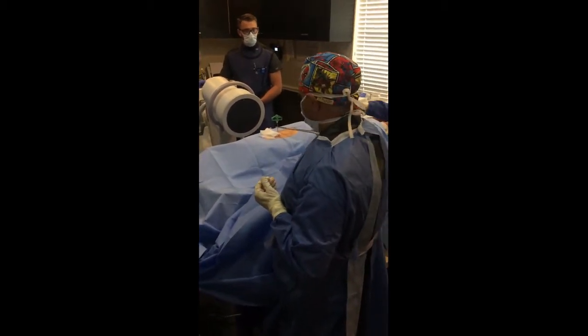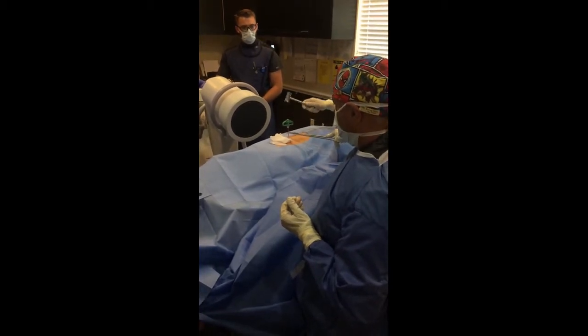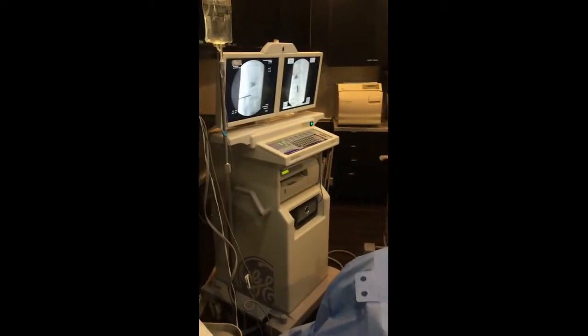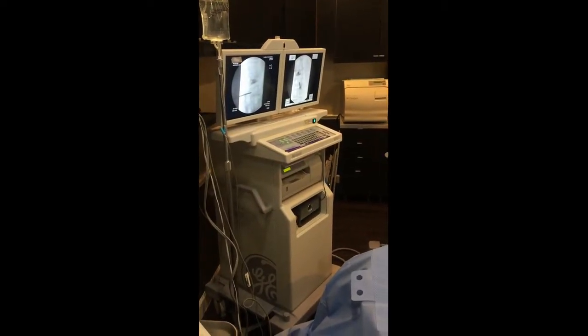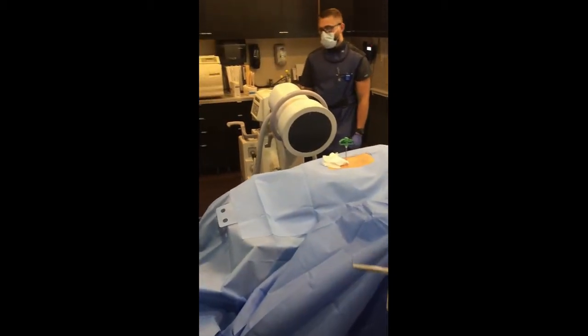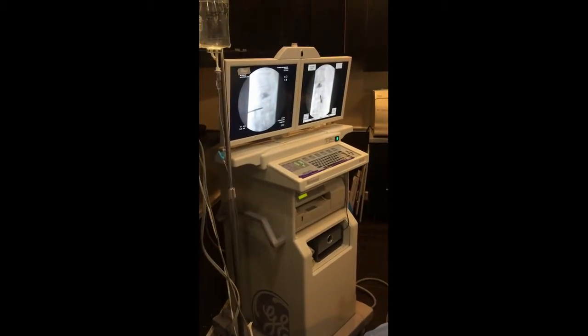We're going to the right spot. At this point, we're going to advance it a little more. Go ahead, Dr. Chen. Perfect. Let's give it a couple more gentle taps, and we'll go ahead and go with the drill. Good. Perfect. That looks fantastic. Okay, we're going to go ahead and go to the drilling portion now, which will be the next portion we let you do.